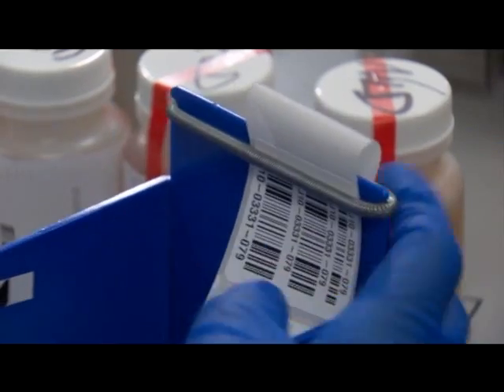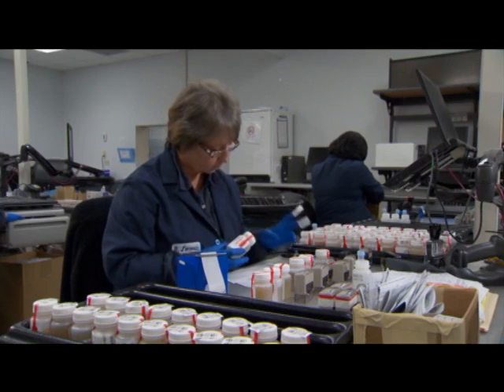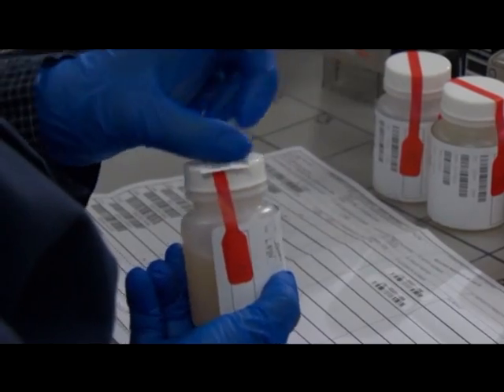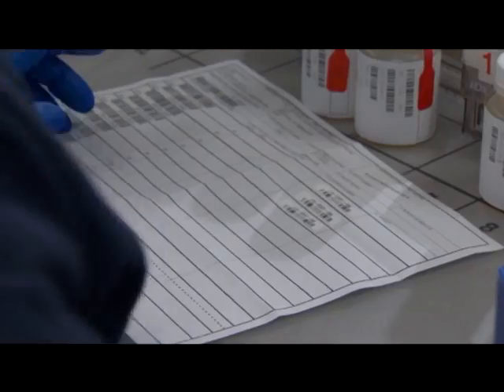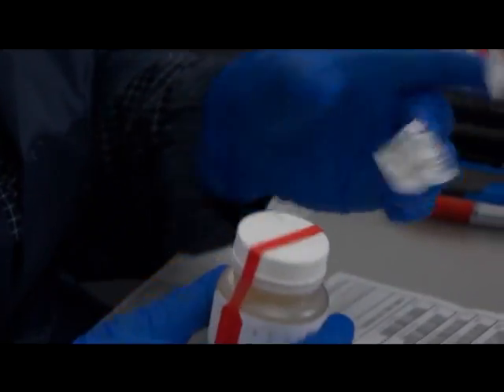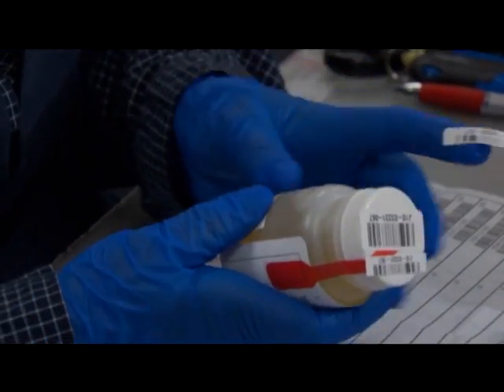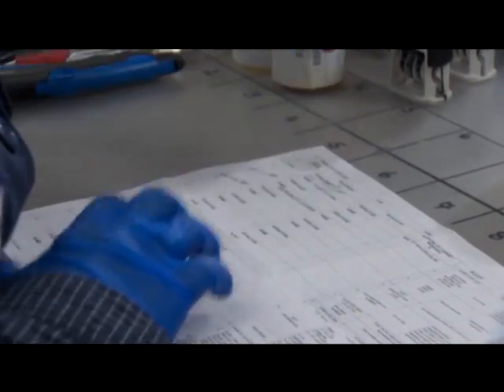Each specimen is assigned an internal LAN, or Laboratory Accessioning number. These labels continue the strict chain of custody protocol which began the moment the specimen was collected. The LAN enables the laboratory to trace the path of each and every specimen from the moment it enters the system to the final step involving results reporting. Additionally, use of the LAN throughout the testing processes in lieu of the Social Security number serves to protect the identity of the service member. The finalized external and internal chain of custody documents are always made available for legal proceedings.